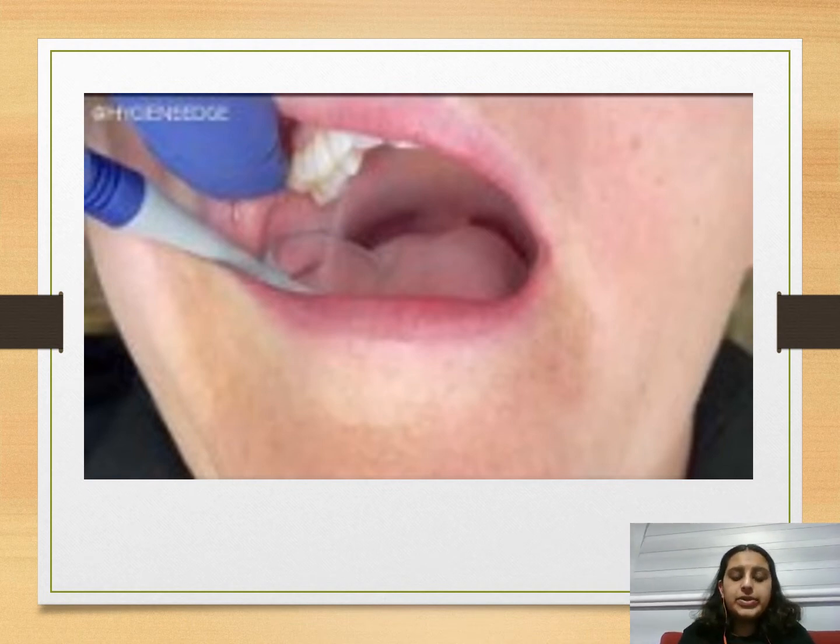So it's pretty common to have those kind of things. So let's start off with there. Be gentle, obviously. I think this is a more sped up video, so just look around slowly, take your time with it, and then you'll just want to go for the buccal mucosa there.